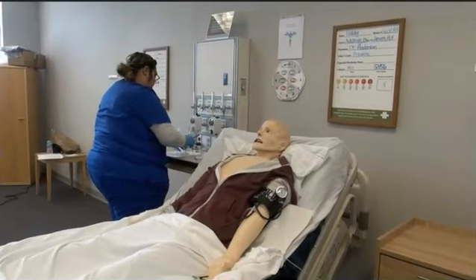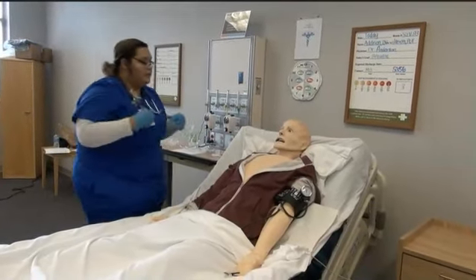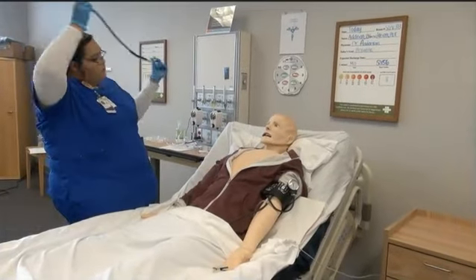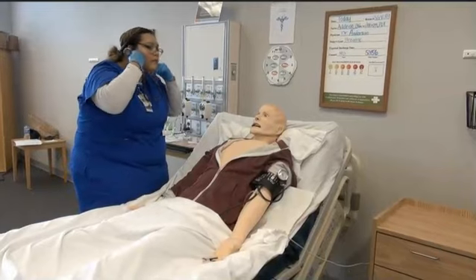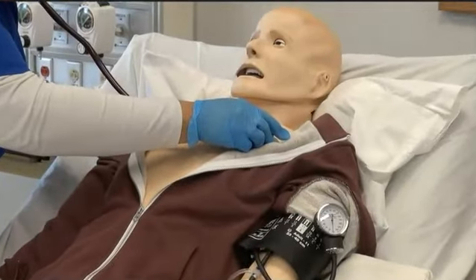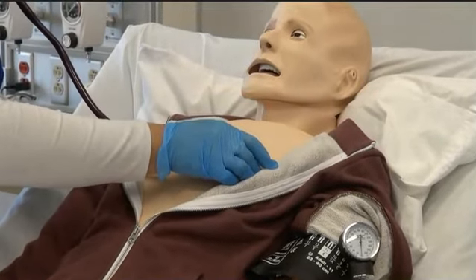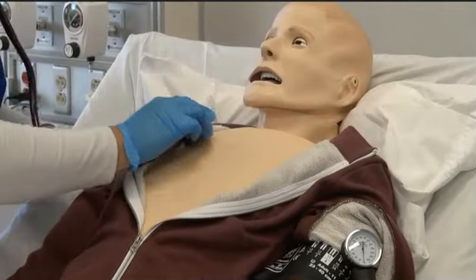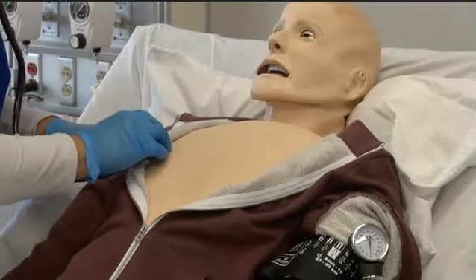So at this moment, I am going to listen to your breath sounds again to see if the medication has worked properly, okay? Performing a post-assessment is important to identify the benefits of it. She will reassess breath sounds, respiratory rate, and the pulse of the patient, and will be noted during documentation.